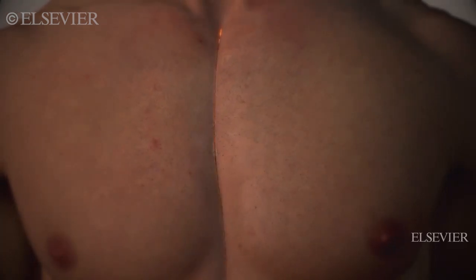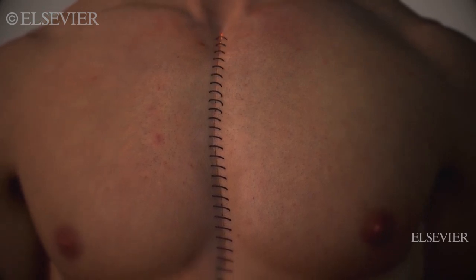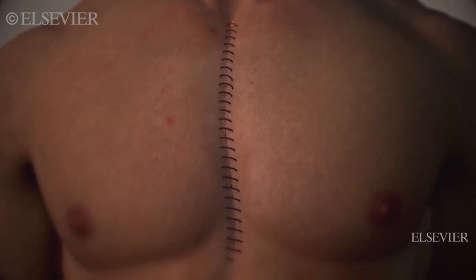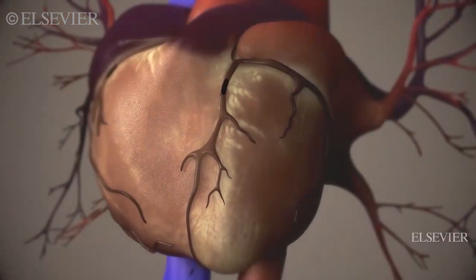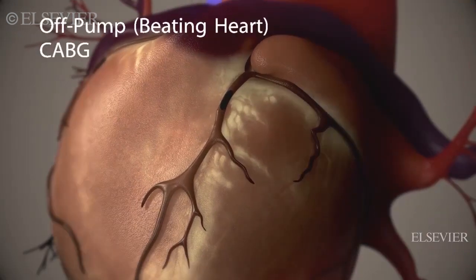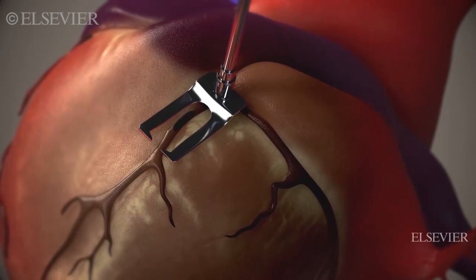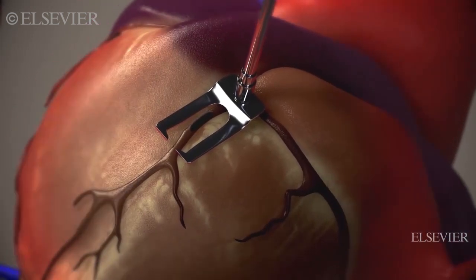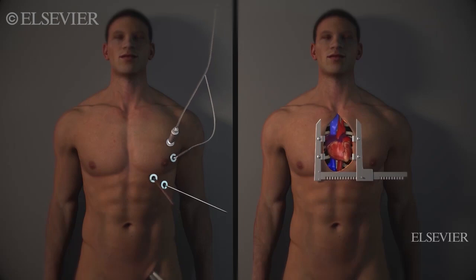Instead of the traditional CABG procedure, a patient may also undergo one of two alternative procedures: off-pump or beating heart CABG and minimally invasive bypass surgery. In off-pump or beating heart CABG, a mechanical device is used to steady the part of the heart where the grafting occurs. In minimally invasive bypass surgery, specially designed instruments are inserted through small incisions in the chest rather than opening the rib cage as in traditional CABG surgery.